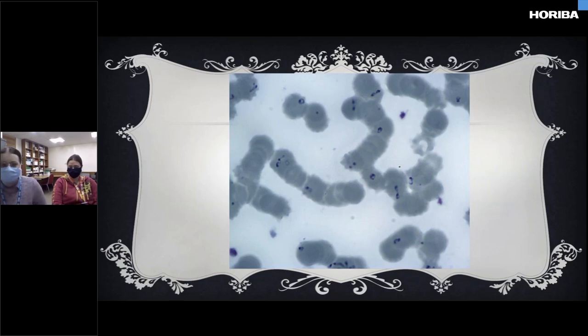And then we found out that she'd been to the Canary Isles in February, but we couldn't work out what it was. We did a DAT and it was negative. And then after phoning A&E, we phoned the hematology consultant and told them about the inclusions that we found.